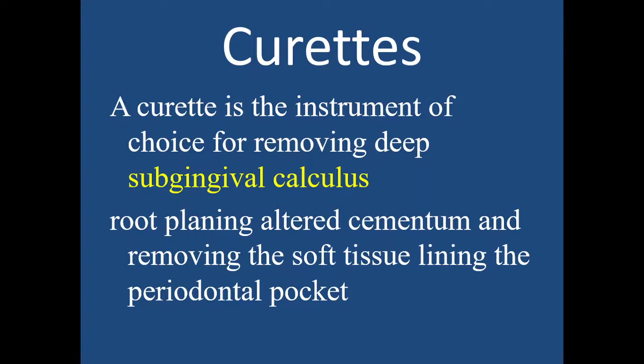So the curettes are very important, and there are many cases that worsen because the doctor does ultrasonic scaling and ordinary sickle scaling without using curettes. So the calculus is present subgingivally, starting the sequence of bone loss, and we will finally face tooth loss.